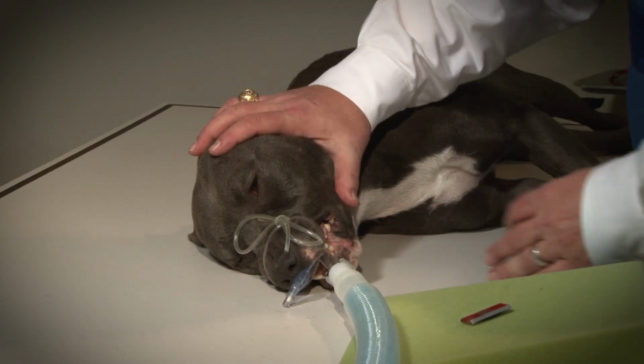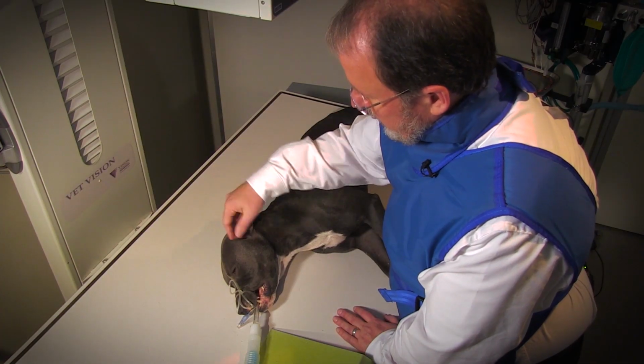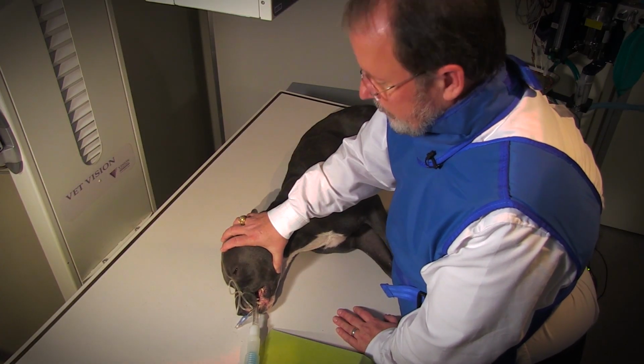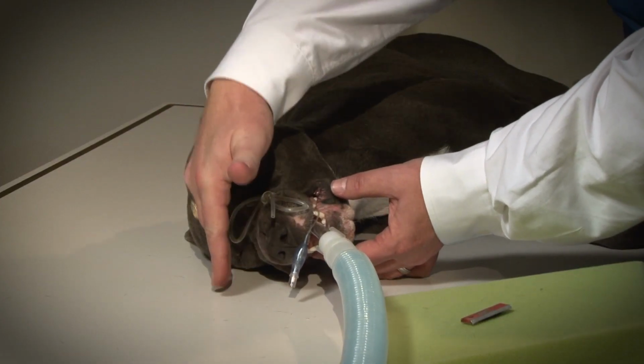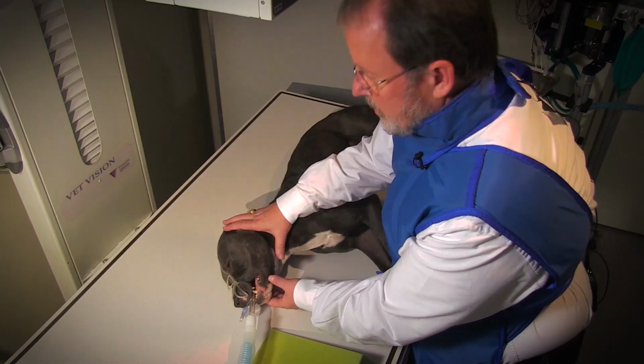And because of that, if we just line them up here naturally, the skull will be oblique, and if we shoot our x-ray, the x-ray will be oblique. So somehow we need to raise the mandible up off the tabletop, so now the eyes are perpendicular to the tabletop and the skull is nice and straight. Well, there's a couple of ways to do that.